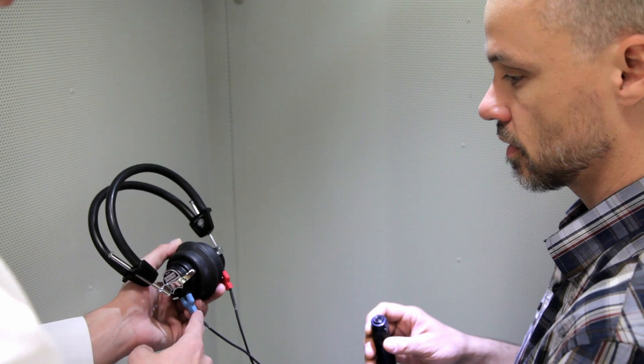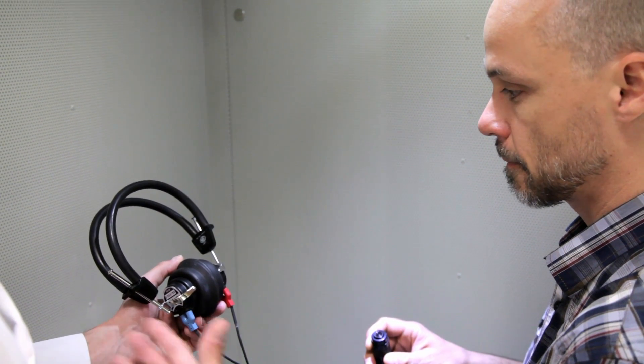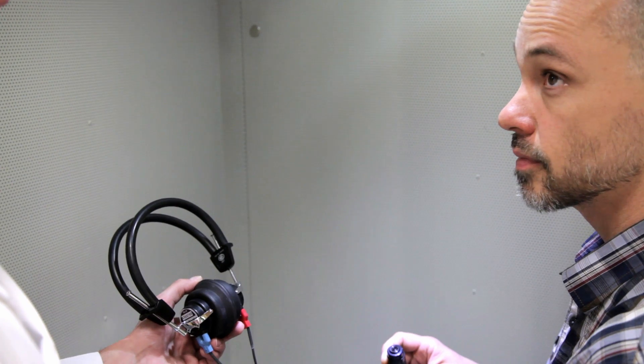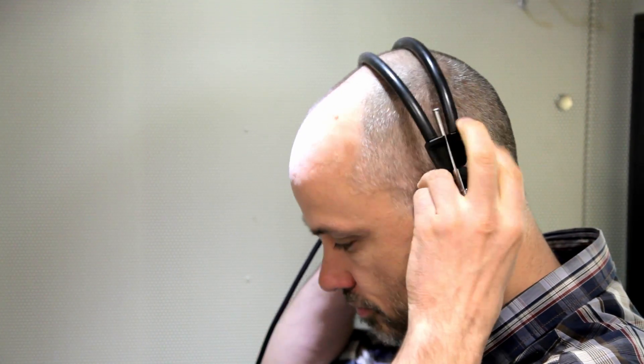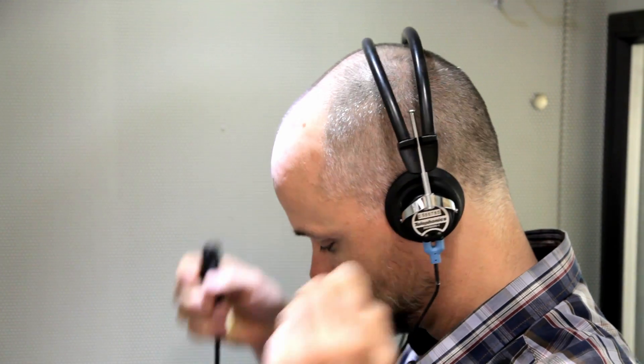Intrinsic Analytics licensed industrial audiometric technicians provide hearing conservation programs for periodic testing for companies with programs already in place. All of our audiometric tests are conducted in specially engineered soundproof booths to ensure acoustic integrity and produce the highest quality and reliability of testing.